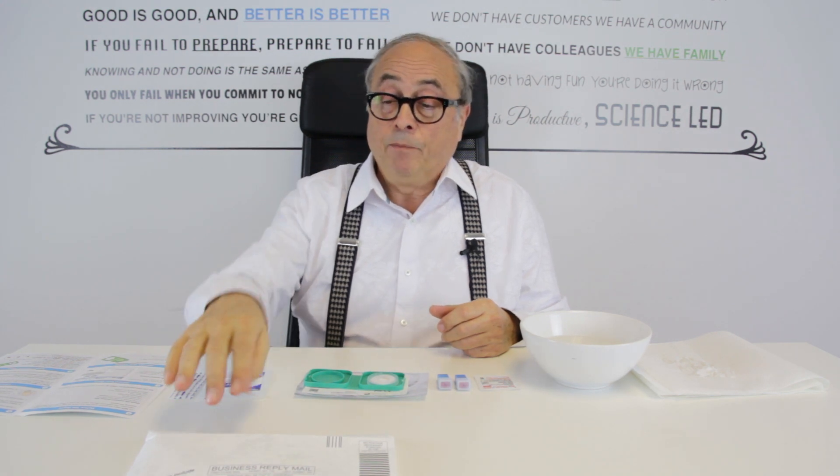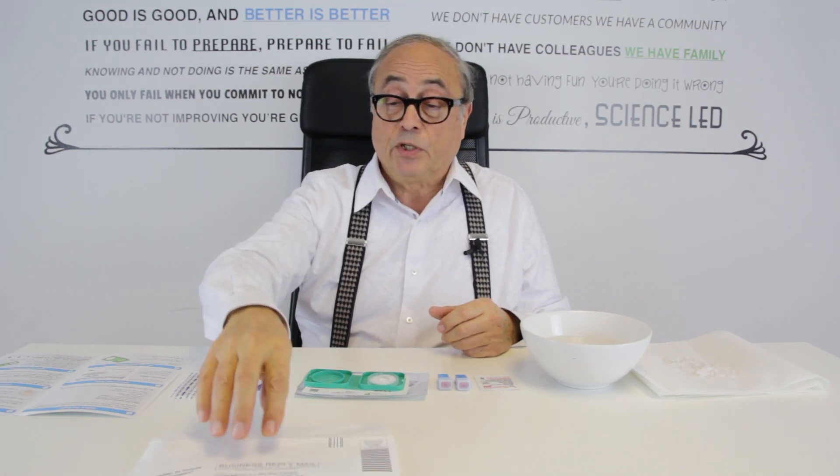Now you're ready to actually do your PSA blood test. I've already filled in the requisition form — which you must do, sign and date — and make sure you put it straight into your prepaid envelope so that you don't forget it. It's already in there.